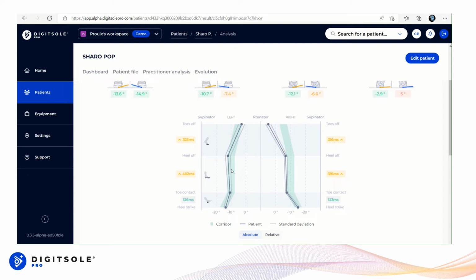That lessens the negative angle and goes towards a heel everted position, not necessarily everted, but towards that angulation. Then as we start to lift off the heel, it might move a little bit more into that heel everted position.